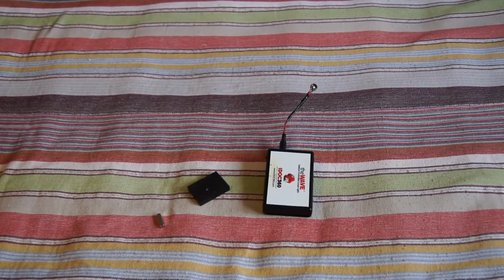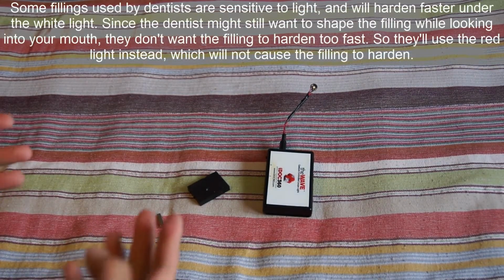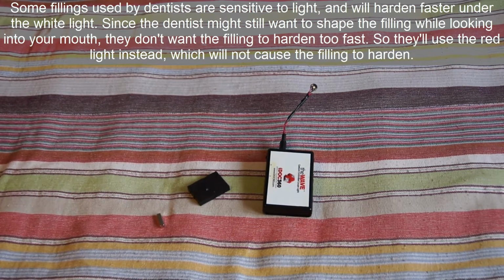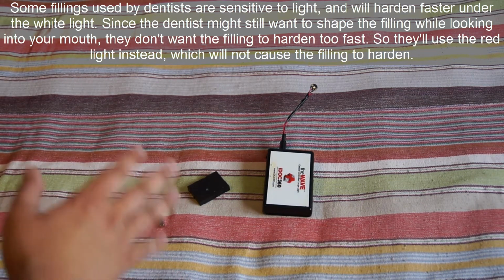Some other features of this system are unique. First is the two lights, the two different colors. Dentists use fillings, and sometimes the fillings are cured by light. Sometimes you might notice the dentist sticks a light in your mouth to make the glue dry faster. But when they look in your mouth, they don't want that. They're still working on the glue, forming it, so they don't want it to dry up. That's why there's two wavelengths of light available on this system. One of them will cure the glue. The red one will not cure the glue. So that's why there's two colors of LED, and this is pretty unique to this system.